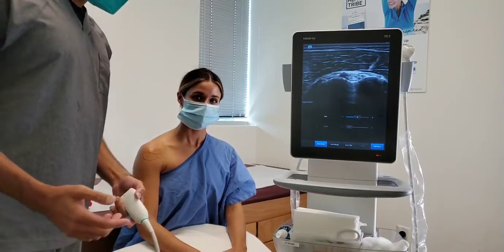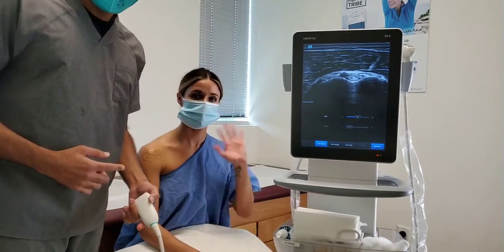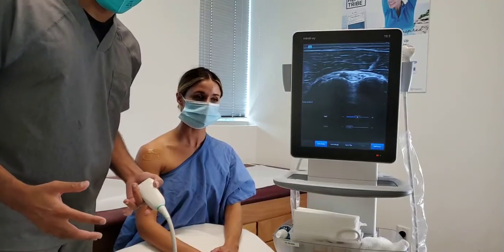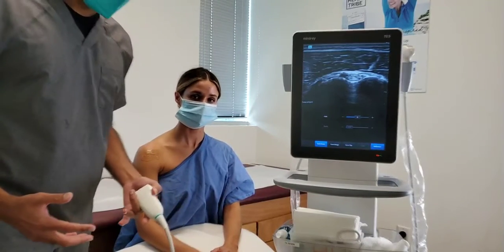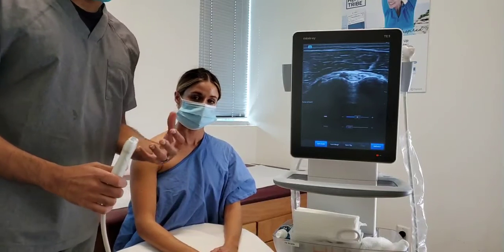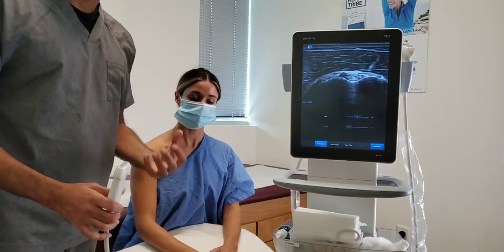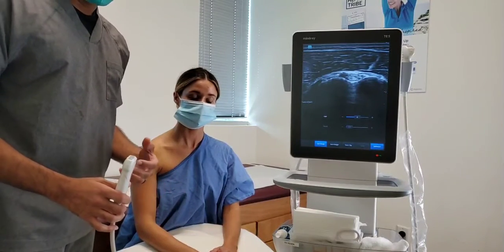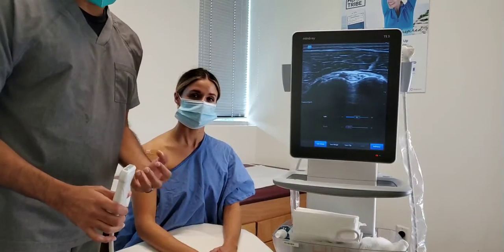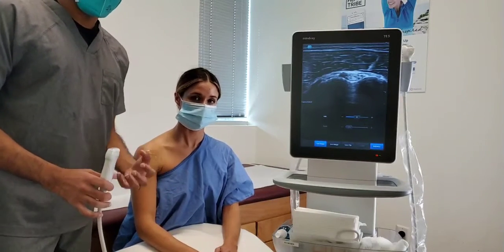Dr. Patel here with our patient coordinator, Lexi, and we are going to be going over a live demonstration of a shoulder ultrasound. So ultrasound, this is the imaging modality that's used to look inside the shoulder. Along with things like MRI and X-rays, this is a peek inside what's going on inside the shoulder joint.